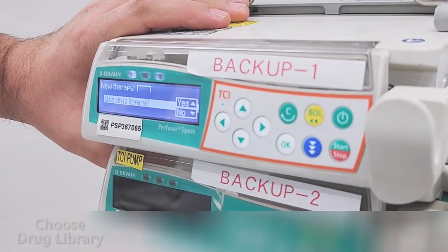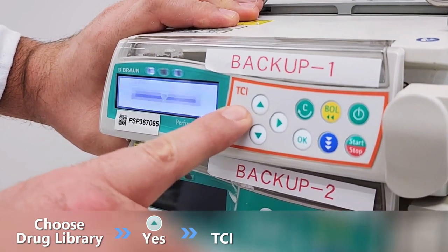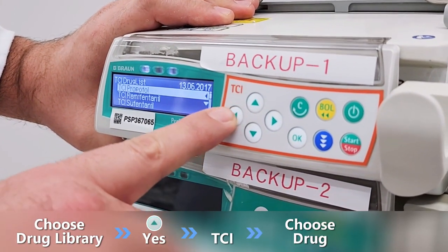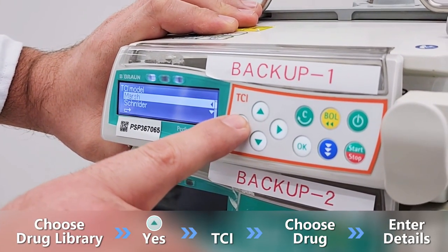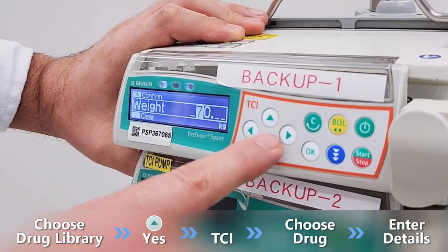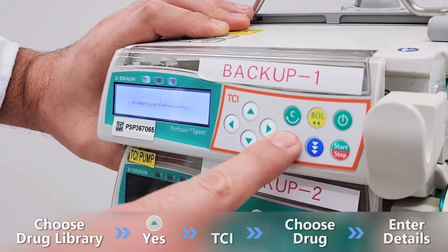To choose TCI mode, select yes, then TCI. Select the desired drug by using the arrows. For this video, let's select Propofol. Set the correct dilution as well as the TCI mode — Marsh or Schnider. Enter patient weight and confirm. Set your target, confirm it, and start your infusion.